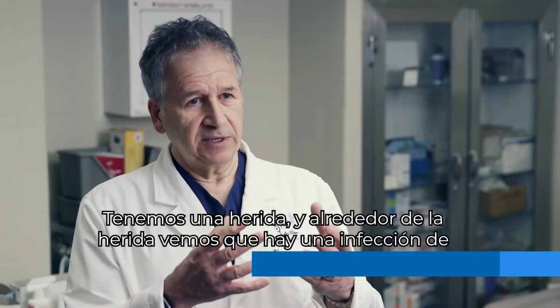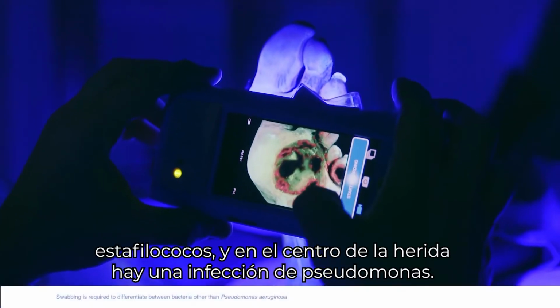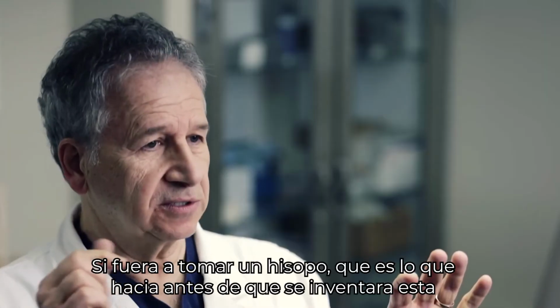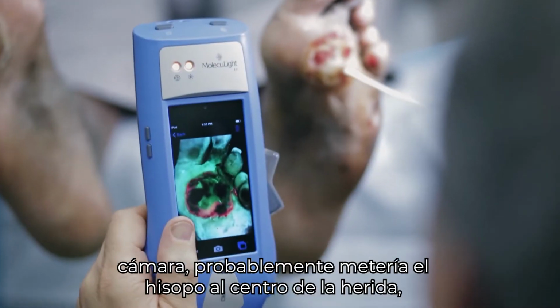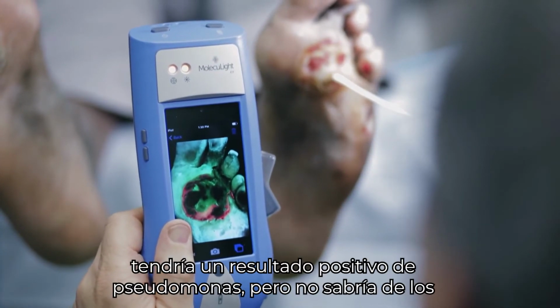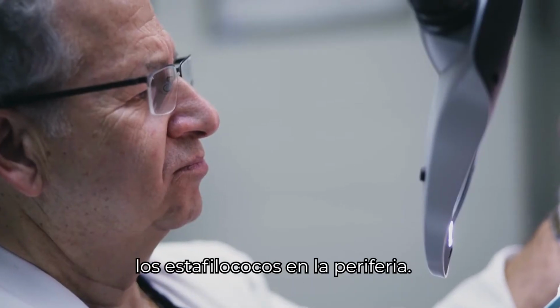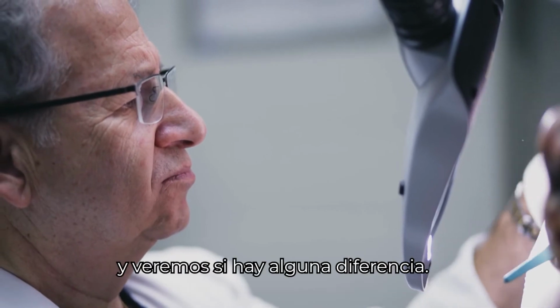You have a wound, and around the periphery of the wound, you may see that there's a staph infection, and in the center of the wound, there's a Pseudomonas infection. If I was just to take a swab, which I did before this camera was invented, I'd probably stick a swab right in the middle of that wound, get a swab that was positive for Pseudomonas, but missing the Staph aureus around the periphery. We'll also take another picture after debriding and see if it's a slightly different picture.